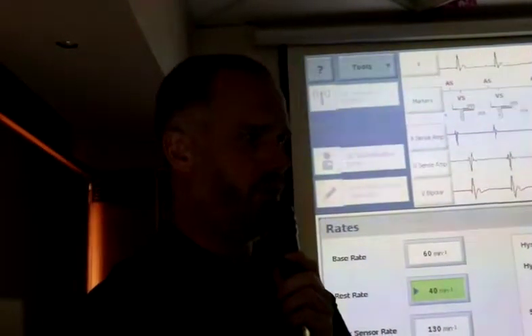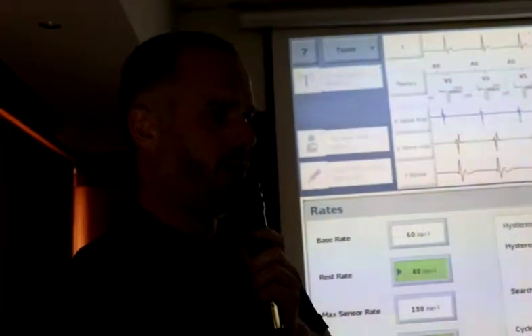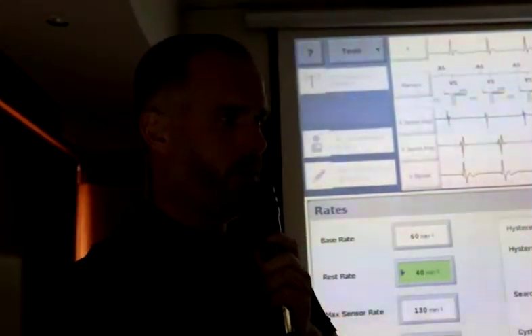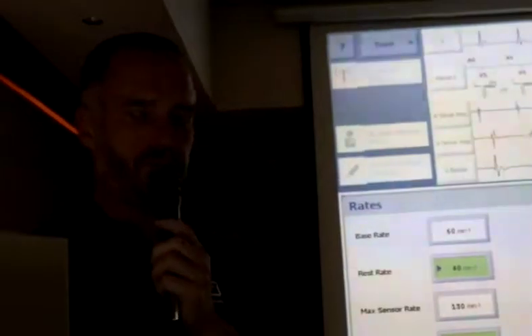But actually, it's really straightforward. But that happens. It's not uncommon. They just made it really bad. This is an important number. It can cause really significant symptoms. So is it logical to increase the maximum track rate to about 180 or 190 from the start for young people with no documented atrial arrhythmias after implantation? I would, absolutely, 100%.